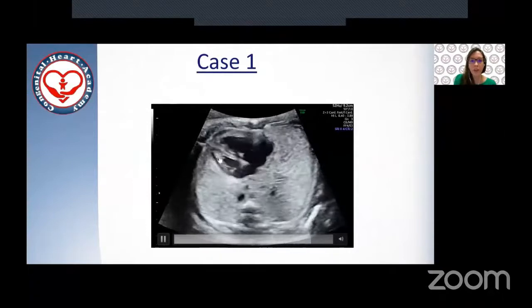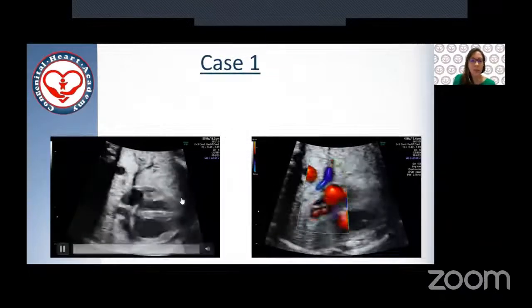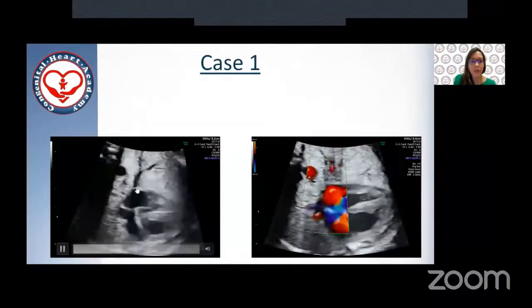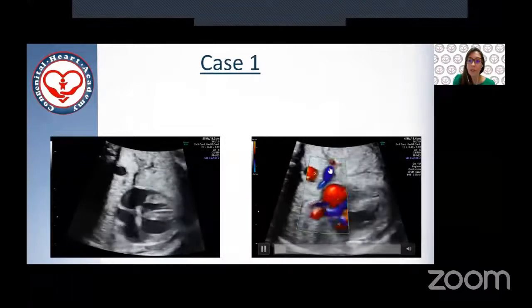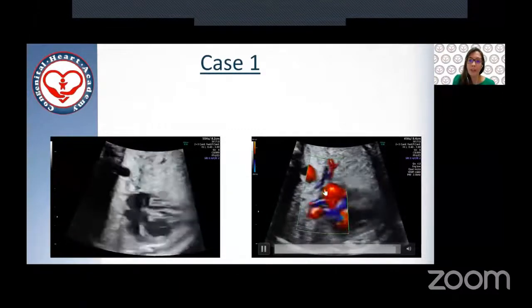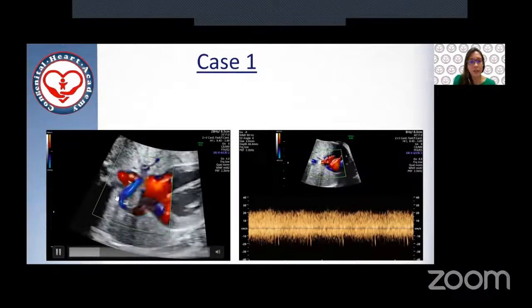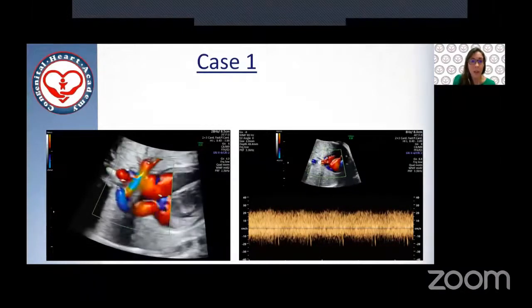The left side structures were smaller, and the area between the left atrium and the aorta was increased. Here again, a four chamber view with no color. This area is increased. We couldn't see the pulmonary veins connection to the left atrium. With a low scale to detect low velocity flow, we could see this venous confluence behind the left atrium. And in this video, we can see the azygos vein connected to the superior vena cava. Again, this flow behind the left atrium was low velocity, but we really couldn't see where it was connected.